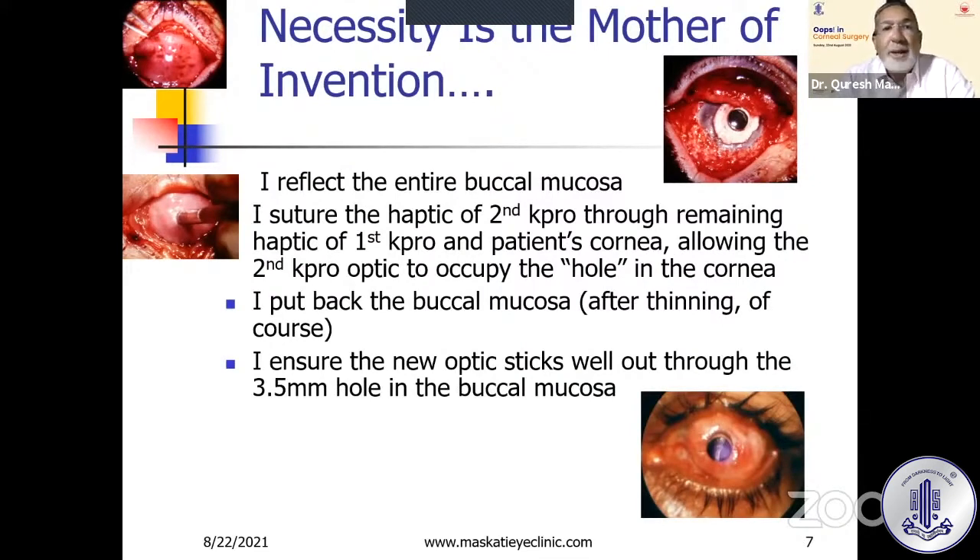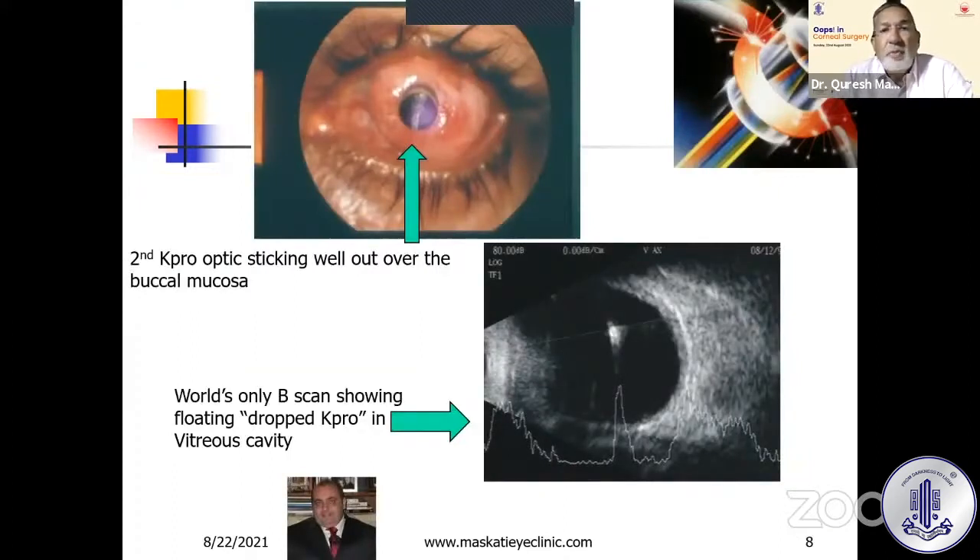The hole was shut because the new K-PRO projected through it, and I put back the buccal mucosa after thinning it to ensure the new optic sticks well out through the 3.5 millimeter hole. You can see the new optic sticking quite out in the lower picture. This is the second K-PRO sticking well out, and this is the world's only B-scan I possess, showing a floating dropped K-PRO in the vitreous cavity — and you can see the spike on A-scan, with Pintucci smiling away from Rome.